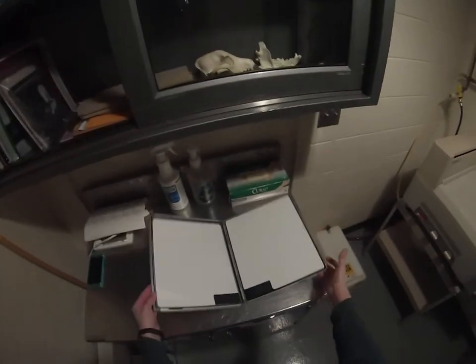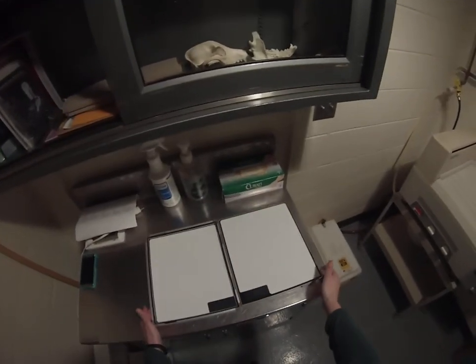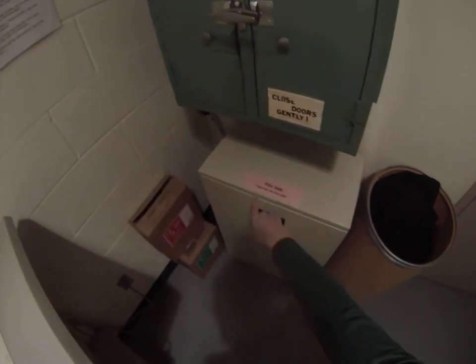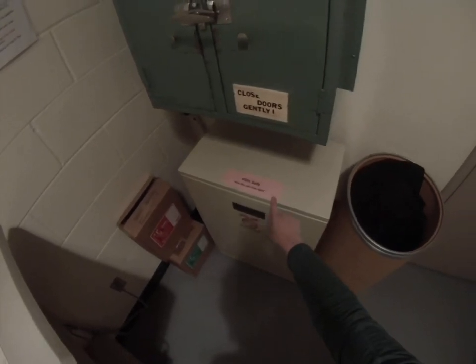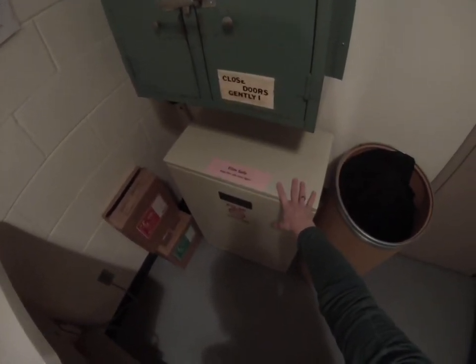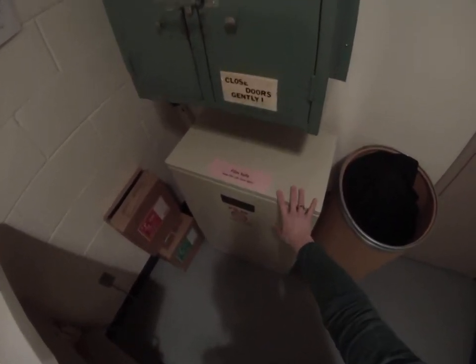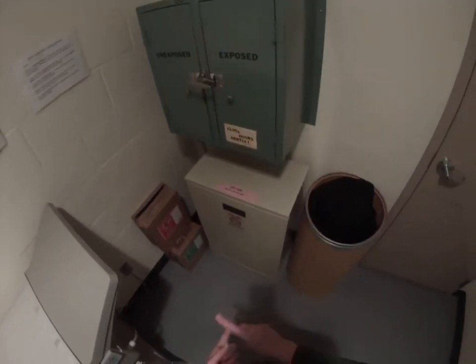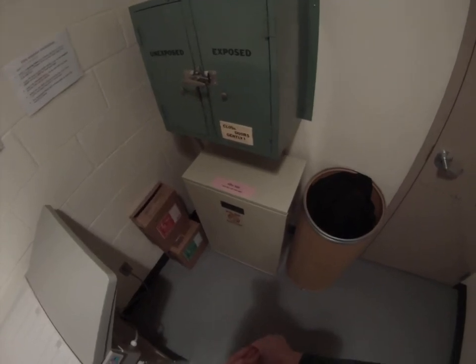We need to reload our cassette with a new piece of unused x-ray film. Radiographic film is kept in the film safe. We have to protect all the film in this safe from visible light, so I am not going to open the safe with the visible light on. But inside this safe, you will find small, medium, and large size film.